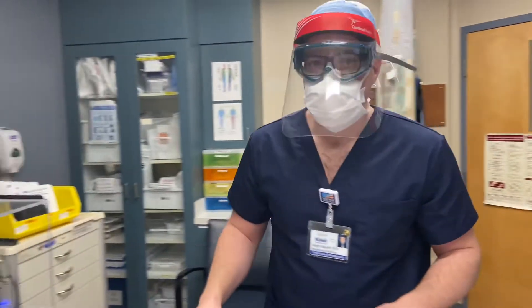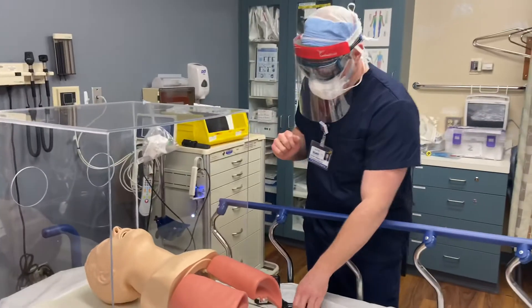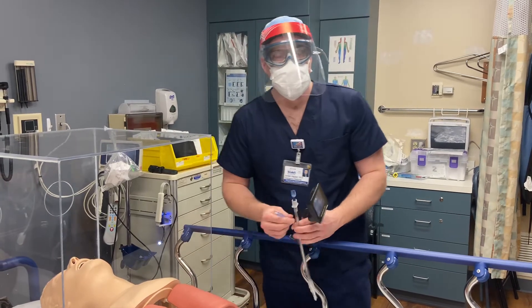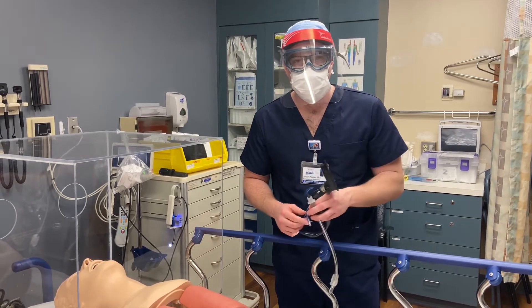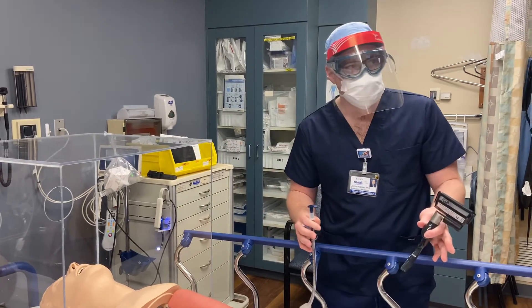Hi guys, it's Capper. With the coronavirus, we are starting to use the GlideScope or video laryngoscopy a lot more. I know a lot of the docs are more experienced with DL — direct laryngoscopy — but I want to show you the proper steps to use the GlideScope. Of course, practice is a big deal.